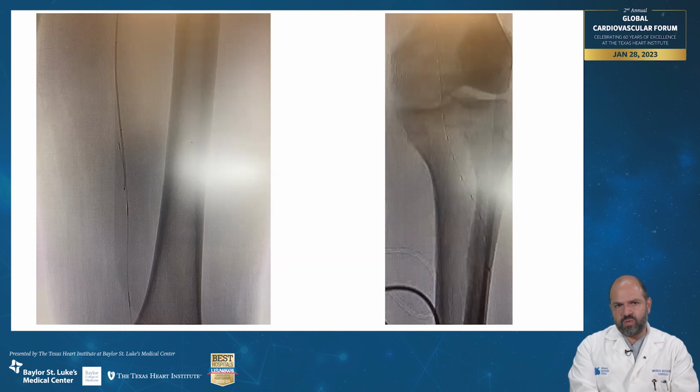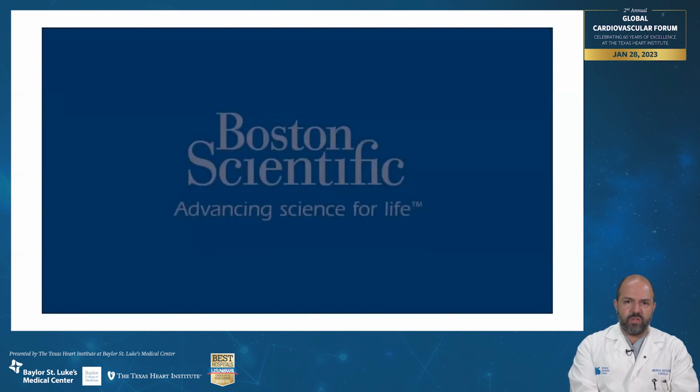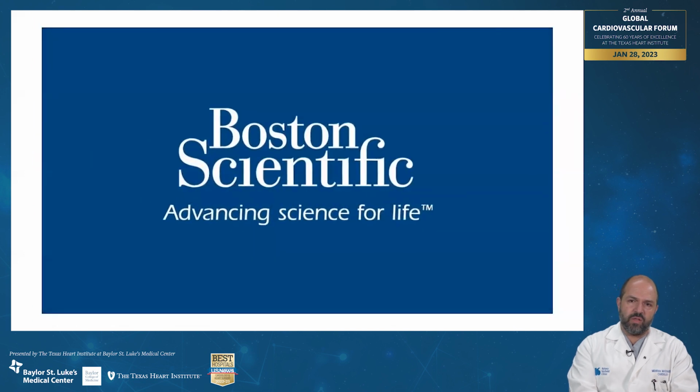Because of the dense thrombotic burden this patient had, we decided to put an EKOS catheter in, which is a lytics catheter that uses ultrasound to slowly drip TPA, and we put it in for about 72 hours. And so this is a little cartoon on how the EKOS catheter works.